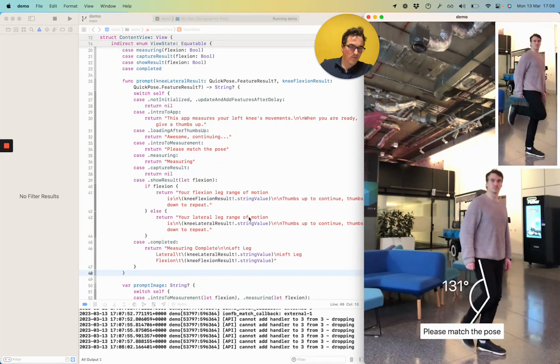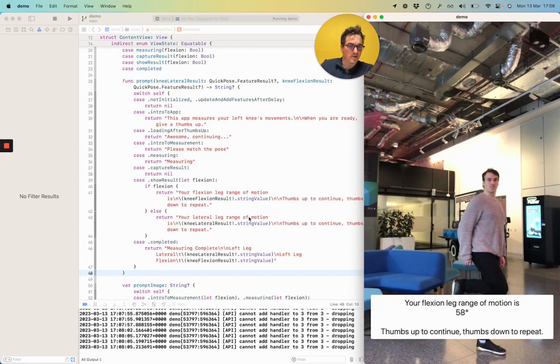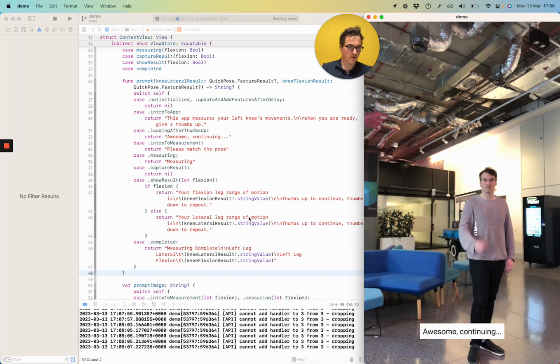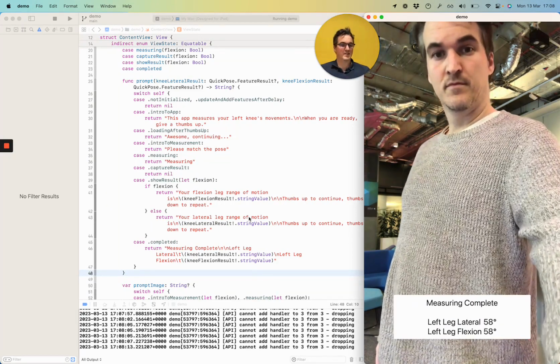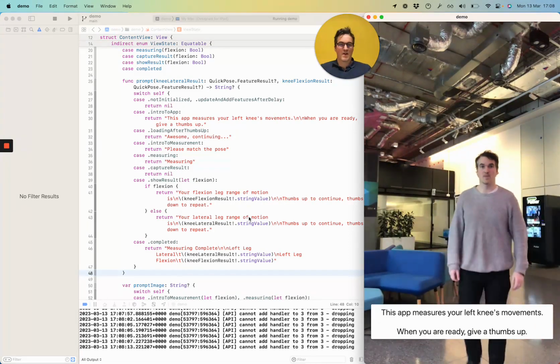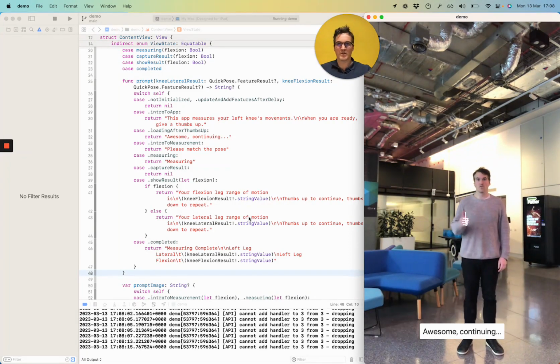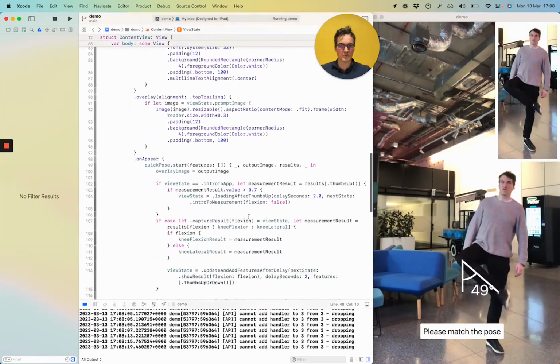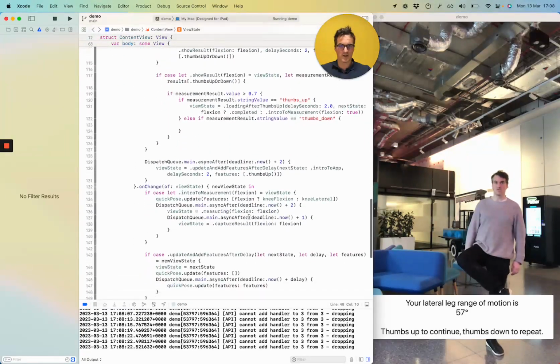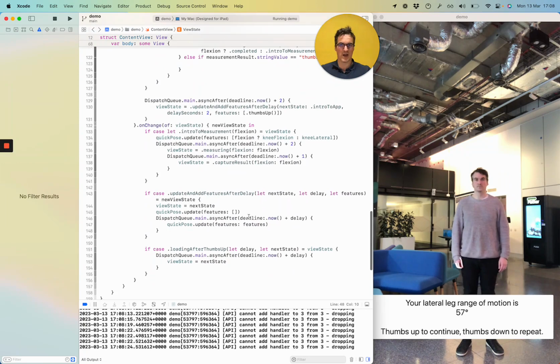There we go. It's gone on to the second pose. Happy with that. And now we're going to wait for the thumbs up. Awesome, continuing. Perfect. Measuring complete. Right, well, we got there. This is sort of close to what I'd consider a kind of production-ready app.